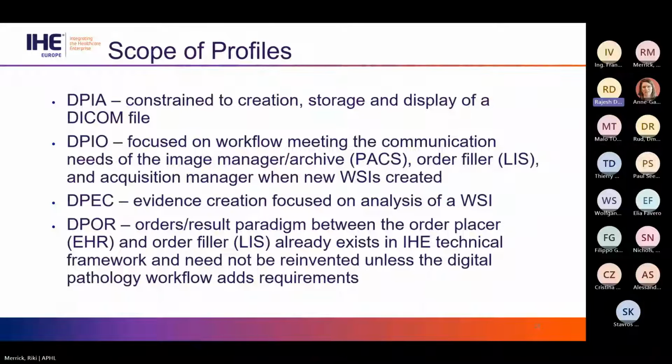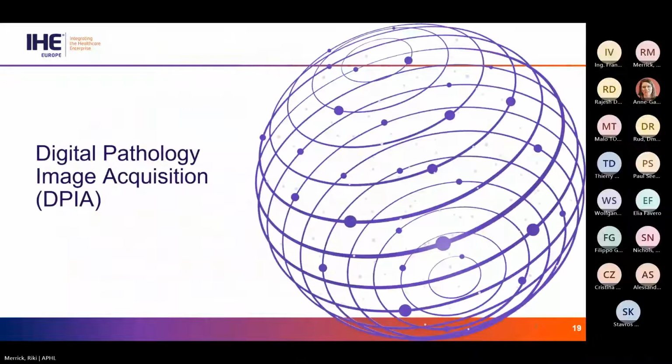Okay, so here's the scope of the profiles. So DPIA, as mentioned, is all about the creation of that whole slide image DICOM file. DPIO is focused on supporting communication in support of the workflow to manage that whole slide image after it's been created. Evidence creation is focused on the analysis of a whole slide image. And then the DPOR is something that we'll take a look at probably at the end to fill in any gaps that exist between the EHR and LIS in support of digital pathology workflows. Next slide. So image acquisition is the first one.